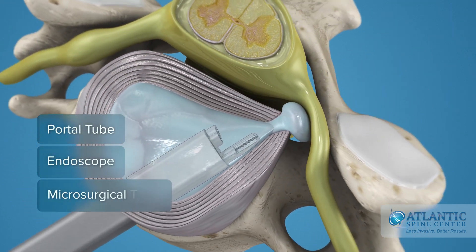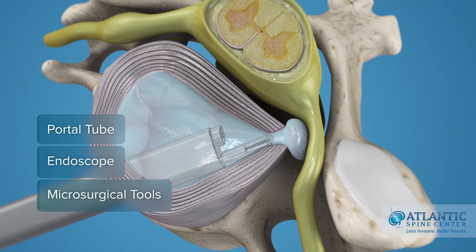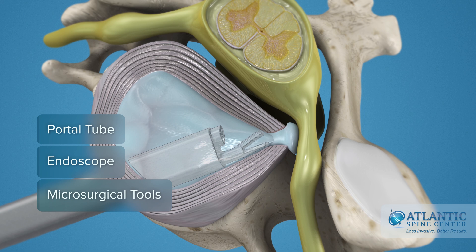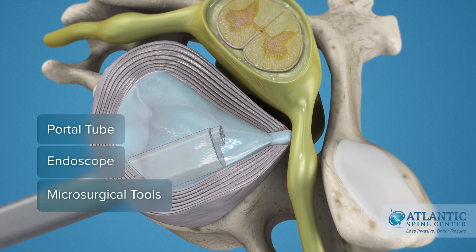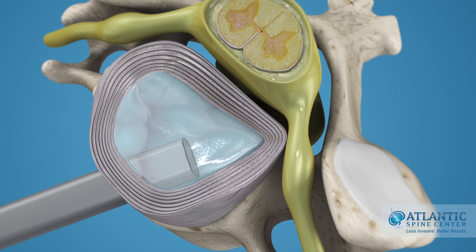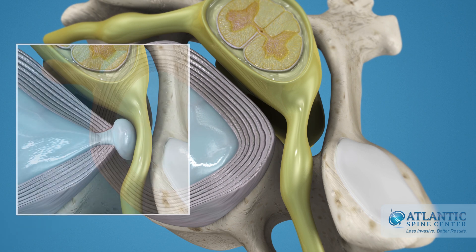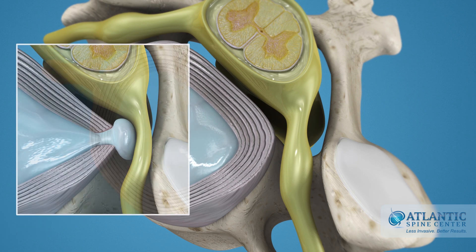Then, the disc herniation is microsurgically removed under direct visualization. This is called a discectomy. The procedure frees space for the nerve root and relieves compression, thereby eliminating the stenosis symptoms.